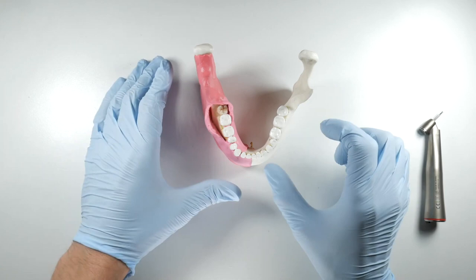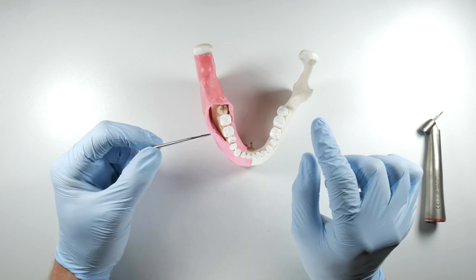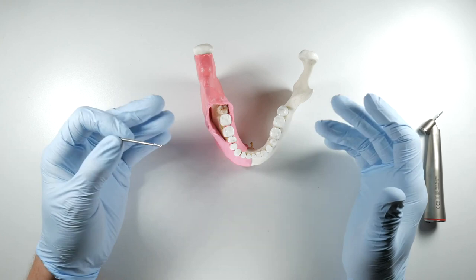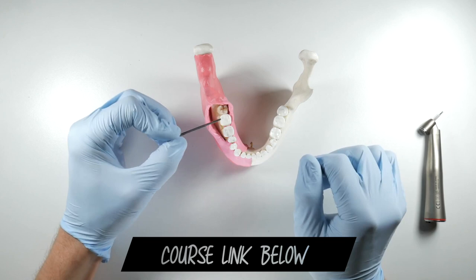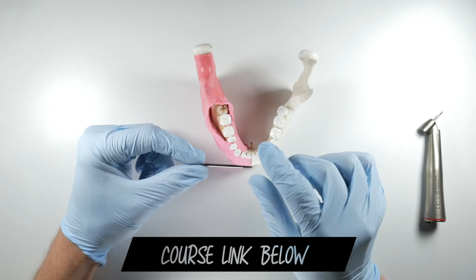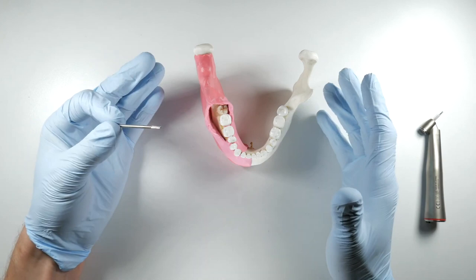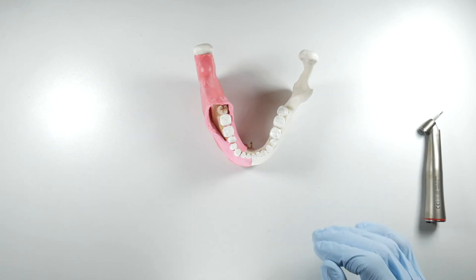Straight handpieces are nice because they accommodate longer burs. The length of that shank actually allows the bur to spin more concentrically, giving you less vibration and less chatter when cutting around these teeth — a smoother, nicer experience for patients, especially if they're still somewhat awake, slightly sedated or just under local anesthetic. Regarding heat generation: sometimes the flutes on these burs get clogged with bone as you're troughing. Stop every once in a while to swipe off the flutes with your finger or a gauze to keep them cutting efficiently. If clogged, the bur generates friction and heat, which damages bone cells, increases post-operative pain, and hinders healing through the post-operative phase.